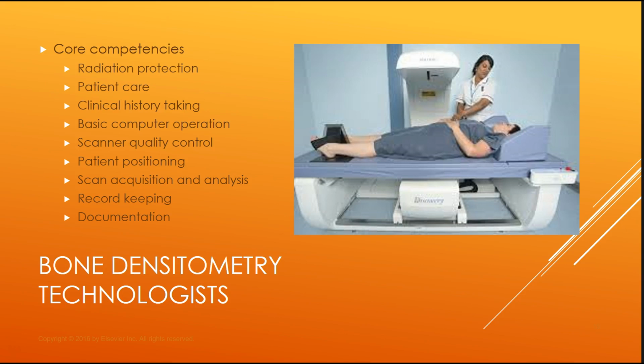Okay, to be able to be a Dexa tech, like I said, it's a technician versus a technologist. They go through radiation protection, they take patient care, they know how to take a history, basic computer skills, basic scanner quality control. Patient positioning, like I said, is imperative in Dexa, so they need to learn that.